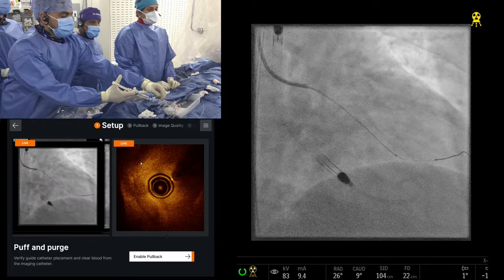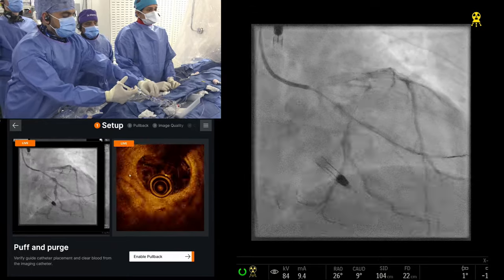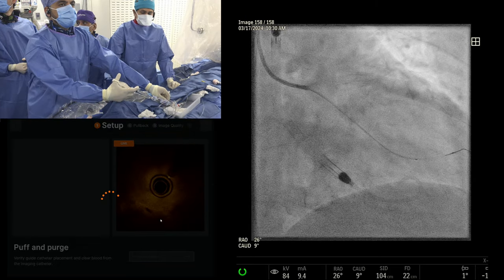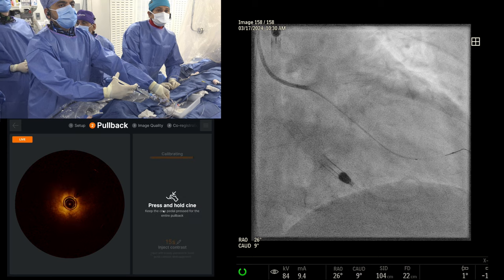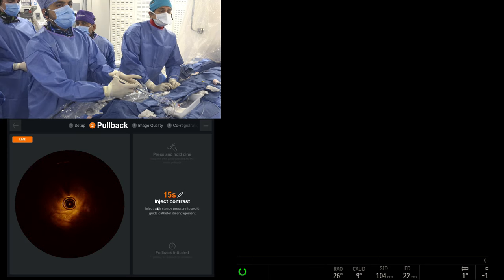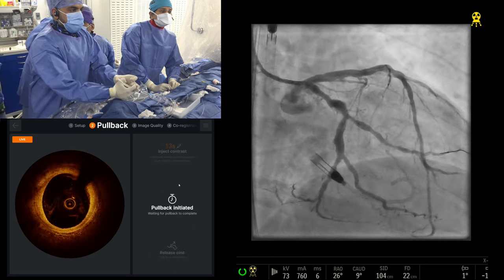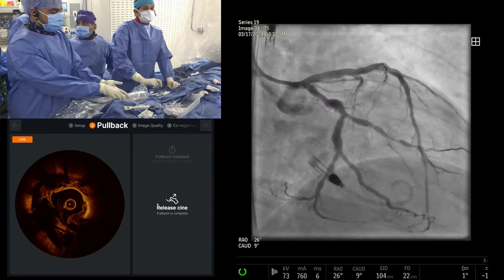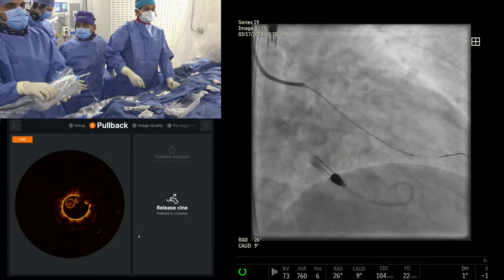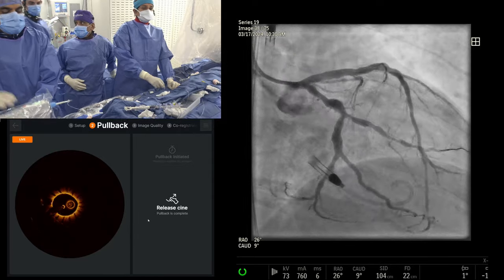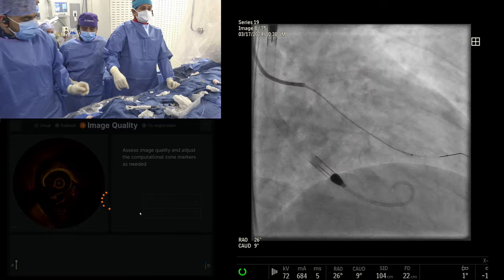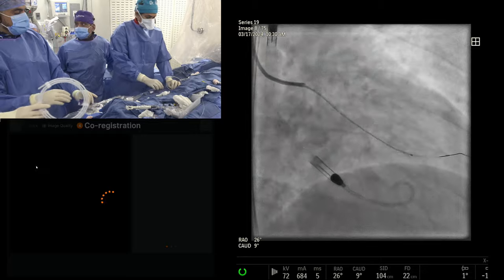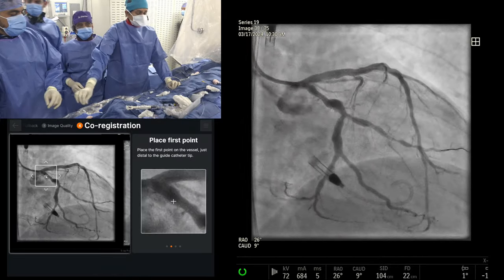That's a very important point. We always go into the ventricle on every case — even if the patient had a prior PCI and is coming for staged intervention — to get an EDP, not necessarily doing dye, just to measure EDP. We're studying the value of EDP and subsequent outcomes with normal EF, mildly reduced EF, and low EF — looking at 17,000 patients in three PCI groups. The question of whether EDP translates into outcomes is commonly asked before Impella in the PROTECT trial.